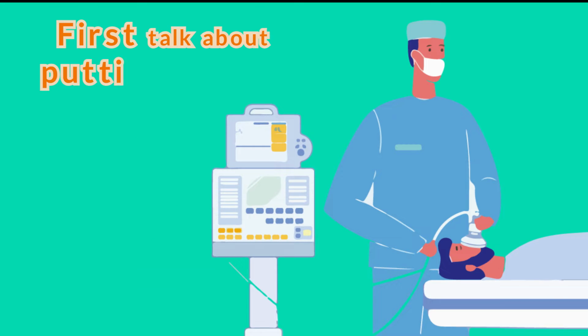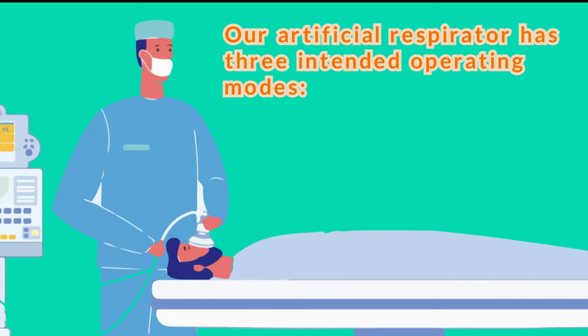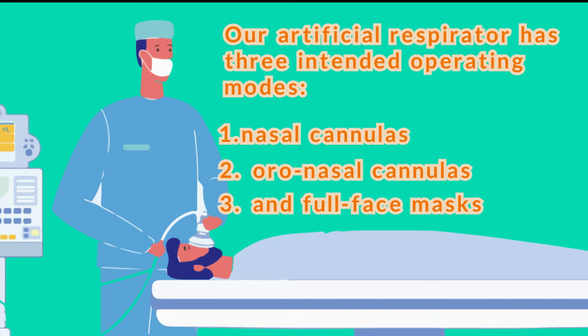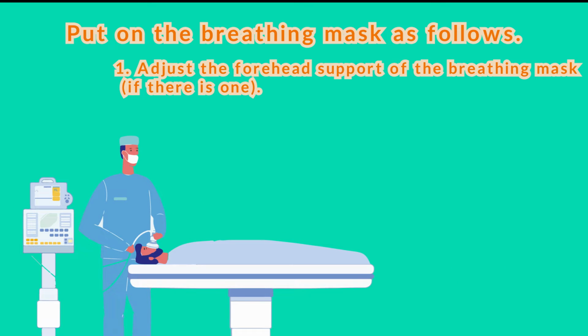First, let's talk about putting on the breathing mask. Our artificial respirator has 3 intended operating modes: 1. Nasal cannulas, 2. Oronasal cannulas, and 3. Full face masks.